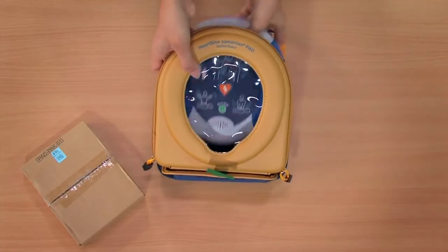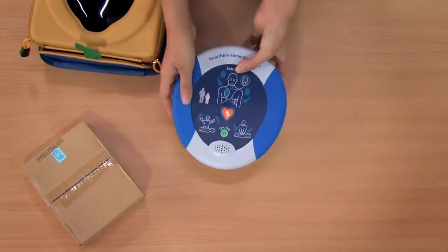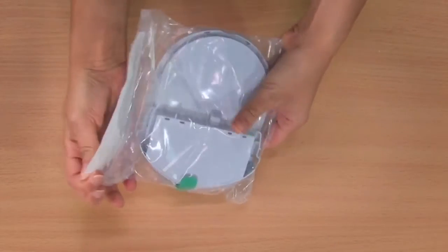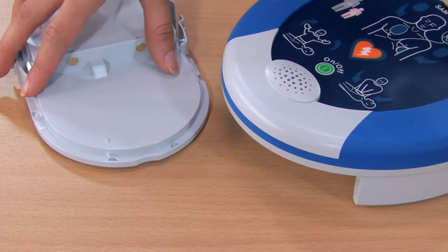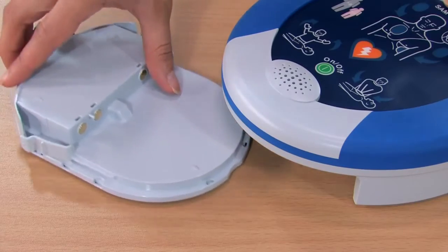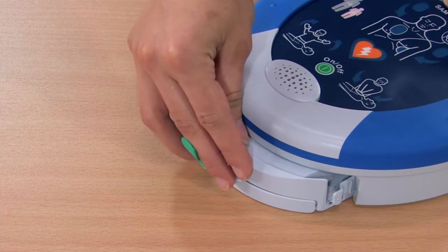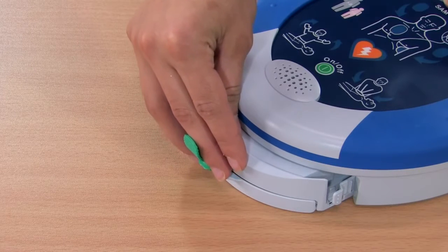Remove the PAD from the case. Then open the packaging and remove the pad pack. Insert the pad pack into the underside of the PAD.